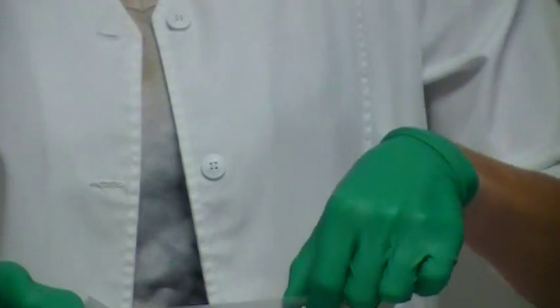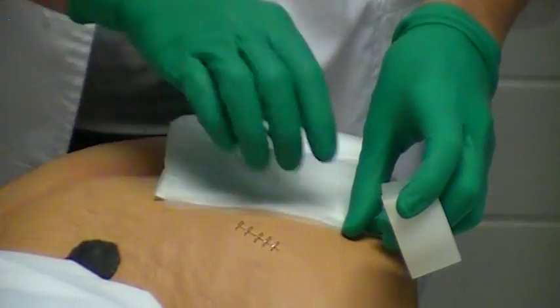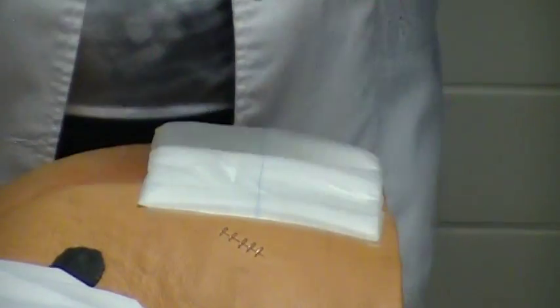And I tell students, once again, if your gloves are really saturated, you may need an extra pair of just clean gloves to put on after you apply this dressing if you do have any kind of drainage on your gloves, because you don't want to get that drainage on your tape. Now, don't over tape. A lot of people like to over tape. Only apply tape to the amount of skin that needs to have tape applied to it.